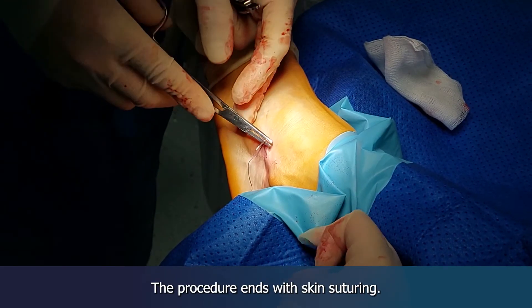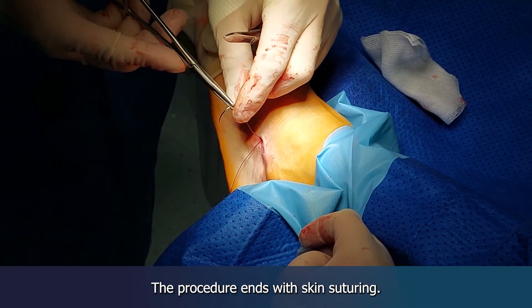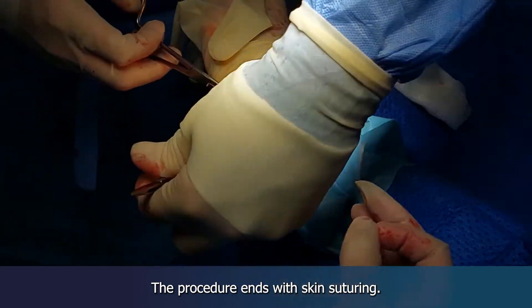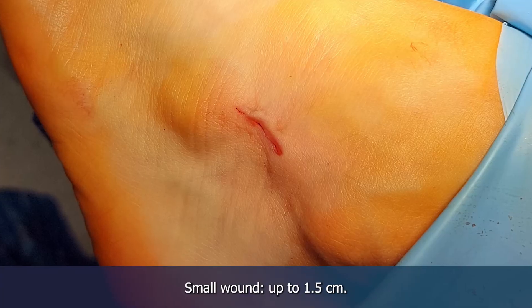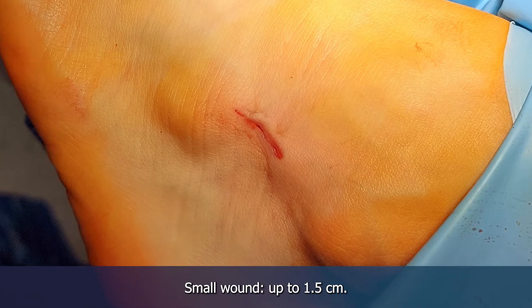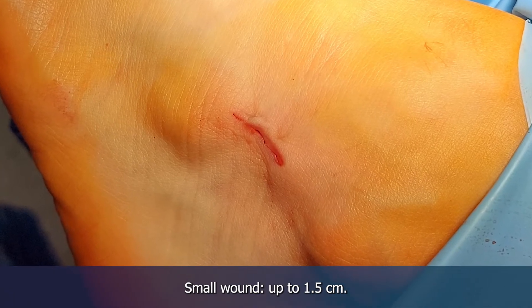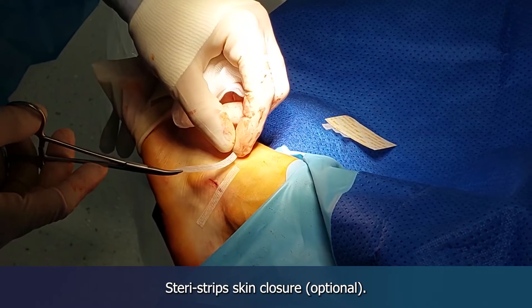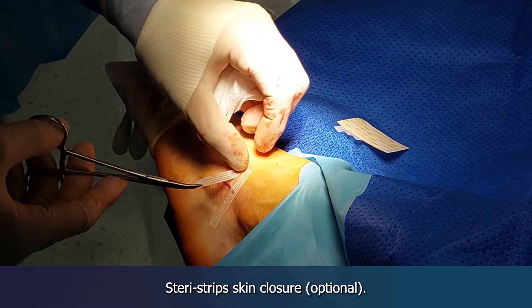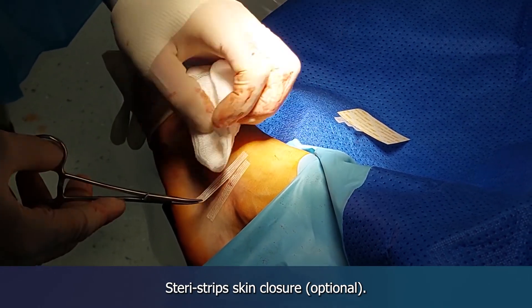The procedure ends with skin suturing. The small wound is up to 1.5 cm. Steri-strips skin closure is optional.